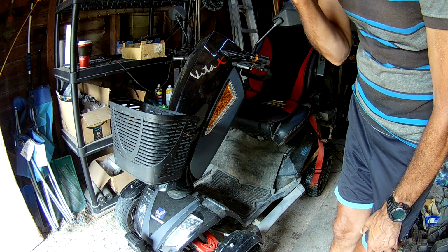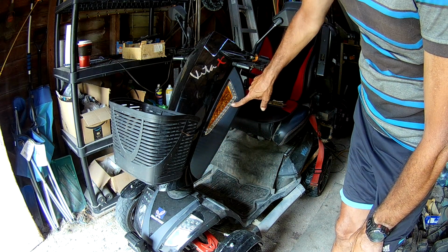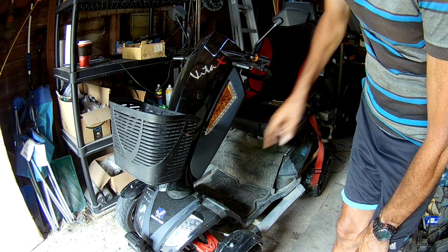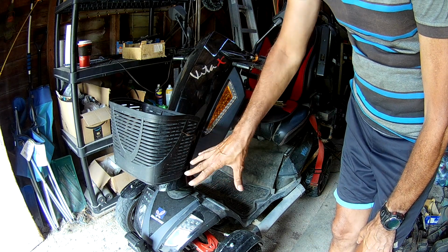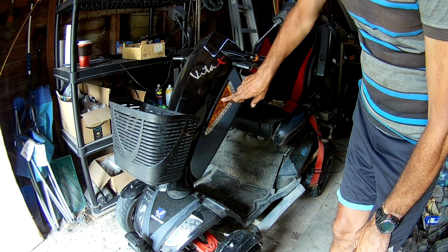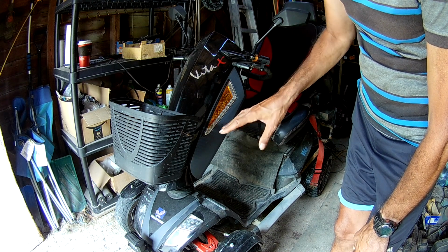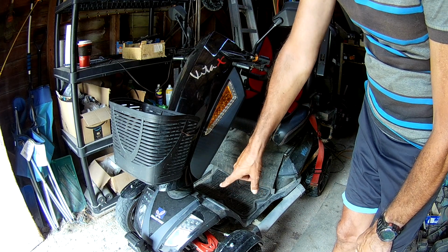So I got thinking, when the headlights are on, orange lights are on down there, and these lights are on. I have those corroded plugs in the bottom, and I thought they were for the headlights. They might actually be for the orange lights, and because these lights and the orange lights never flash, the headlights come on separately, and the four-ways are separate. It's possible that these white lights and these orange lights are on the same circuit. So if those plugs down there are toast, is it possible it's one big loop?